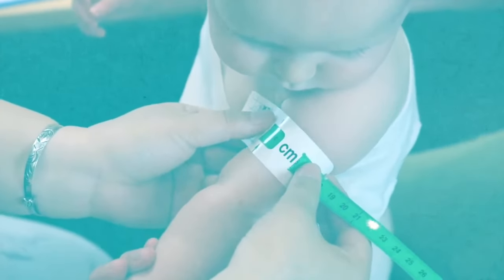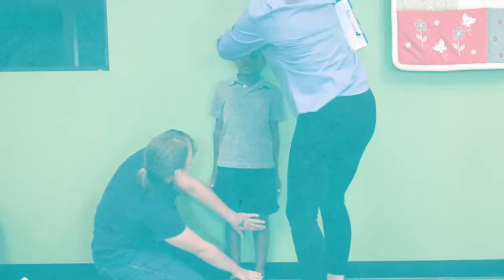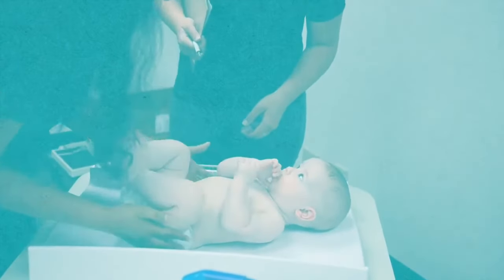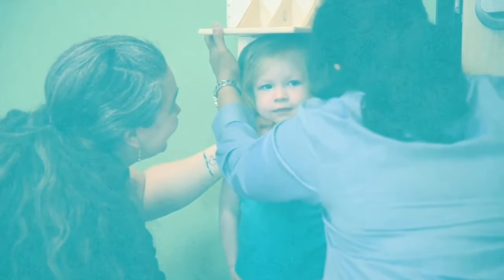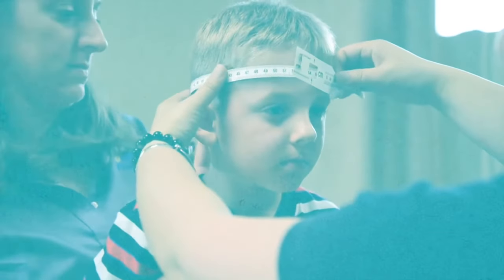Holt International's Child Nutrition Program is designed to standardize child growth screening protocols to ensure that children are growing to their full potential. An important part of this process is anthropometric measurements, which refers to the way that children are measured and includes measurements like height and weight.